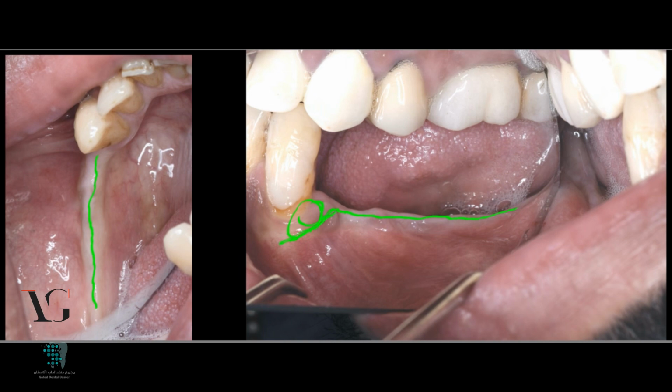We go in this manner, and then in an oblique incision on the keratinized tissue, when we are just touching the mucogingival junction, we go in a perpendicular manner. And this will prevent scarring, as well as give us the opportunity for perfect visualization of the area, perfect grafting of the area, and everything we want to do in such an area.